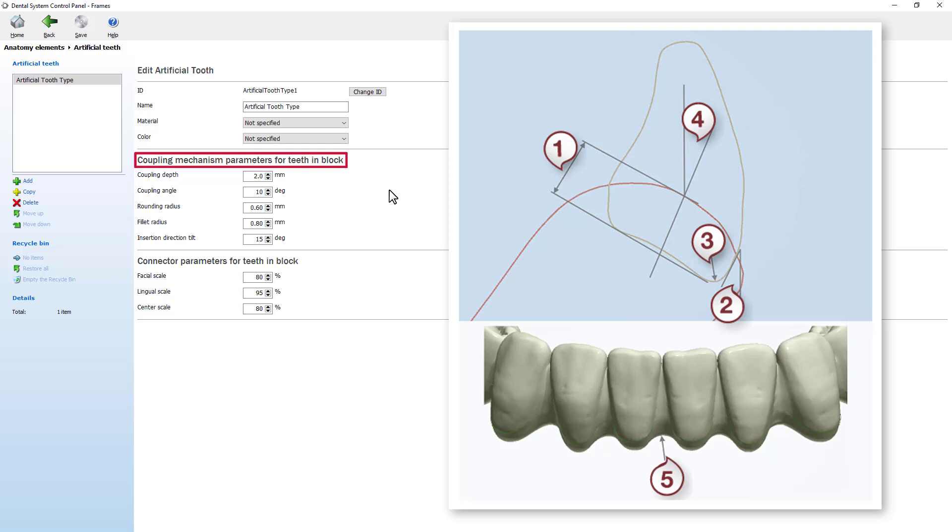For example, set the coupling depth or angle, rounding radius, fillet radius, and the insertion direction tilt.